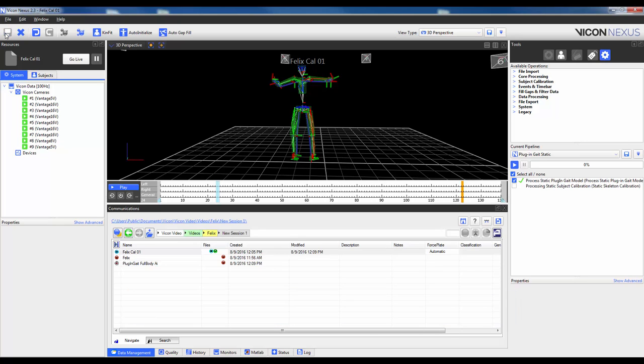So from here, I'd be ready to capture a dynamic trial by hitting go live, and then going into the data capture tab.